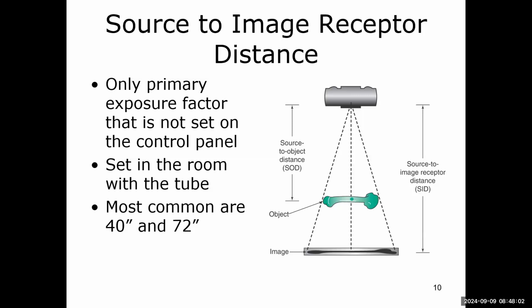In our rooms, at the upright wall bucky, I know she's just letting you use it where it locks in because that just simplifies things with that room. It hopefully will let it sense the size of the detector so that your collimation opens up correctly. It should help with making sure that your alignment is correct. So just know that 40 and 72 are the standards.